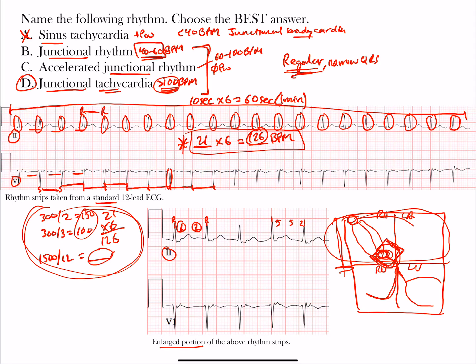Regular narrow QRS complexes, no P waves preceding, and differentiated by rate. Because the rhythm starts from the AV junction, it goes down to the ventricles but also sometimes goes backwards.